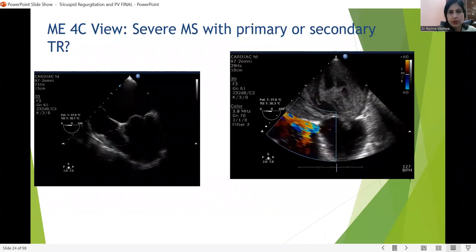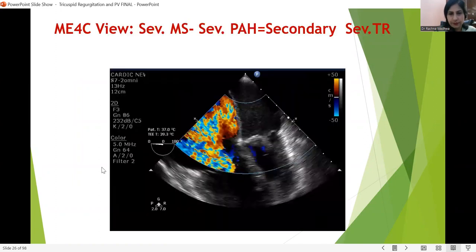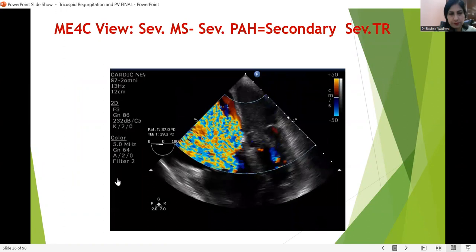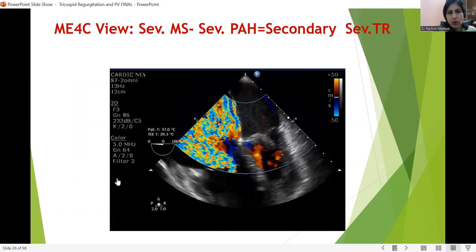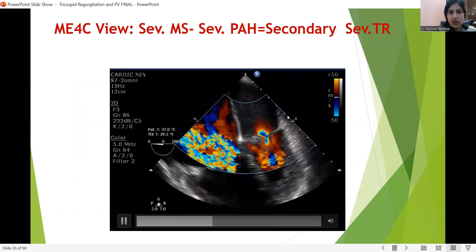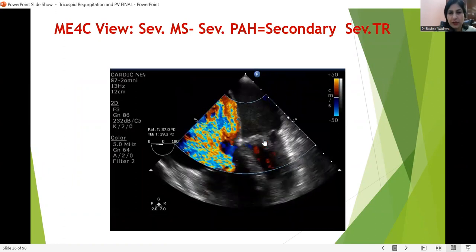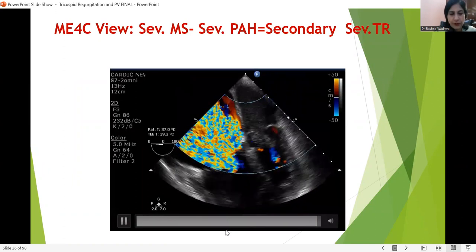This is the 3D morphology of the tricuspid valve seen from above — the septal leaflet, the anterior, and the posterior. Another view is showing torrential tricuspid regurgitation in cases of severe MS — we can see the PISA of MS being formed here.